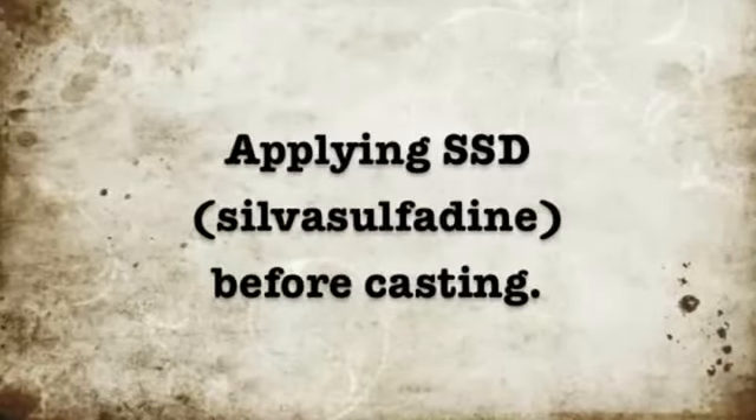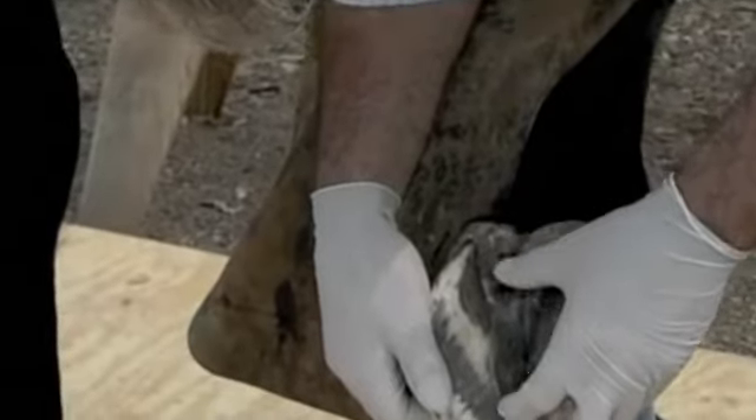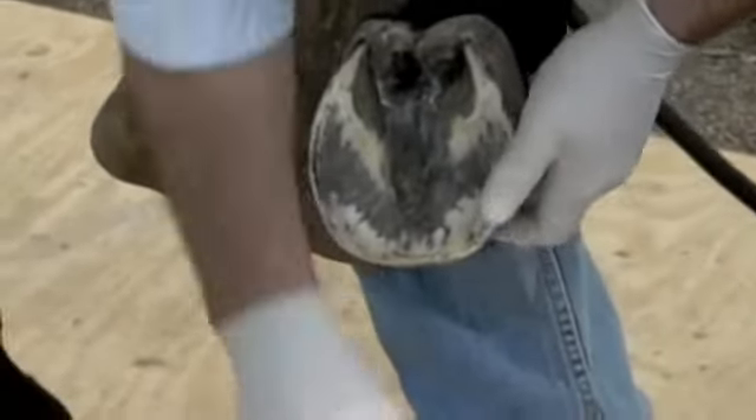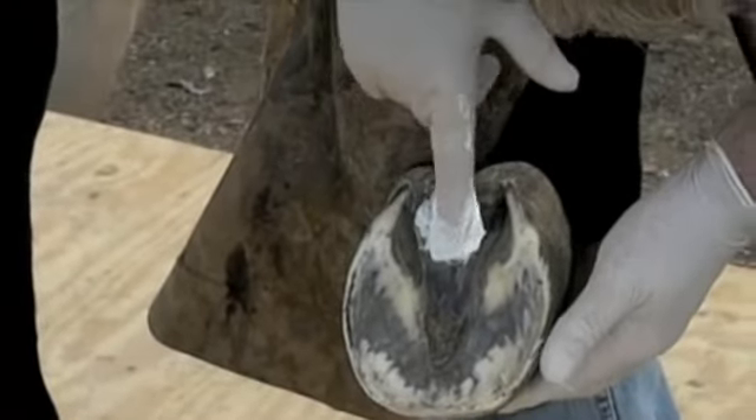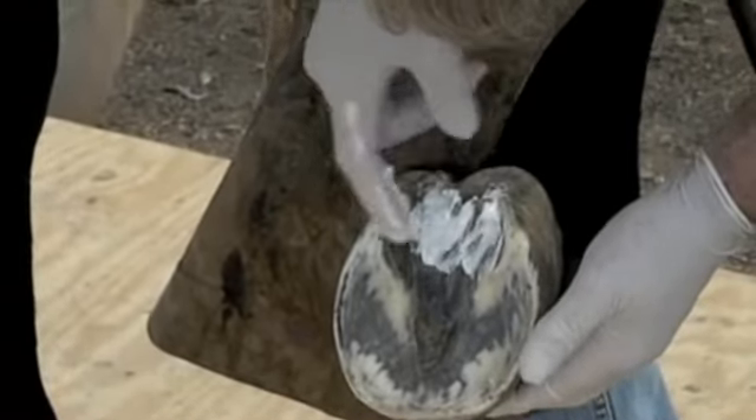Applying SSD, silver sulfadine. Make sure that you put plenty of silver sulfadine on the frog, the sulcus of the frog, the collateral grooves, and any white line diseased areas before casting.